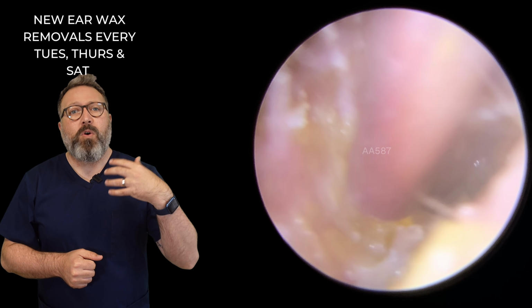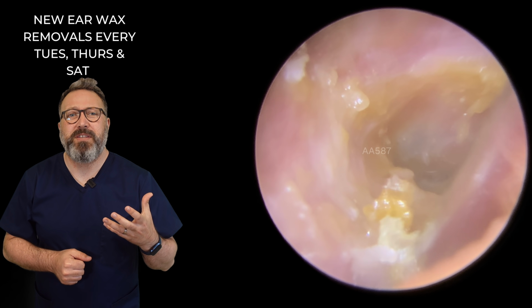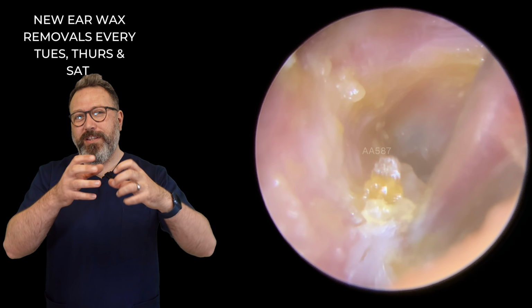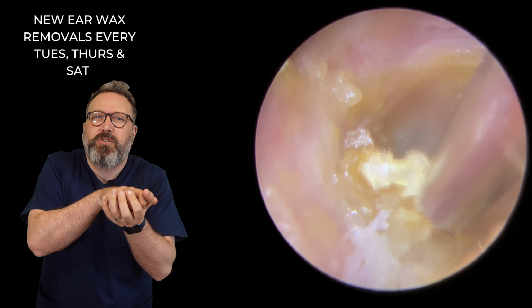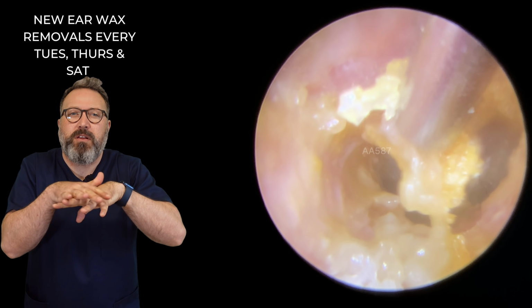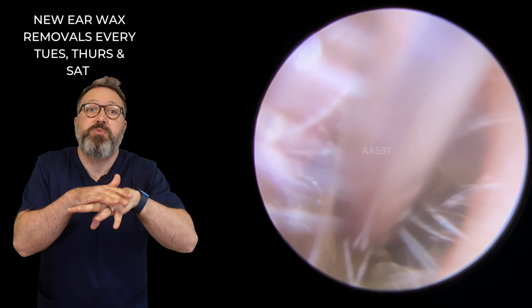Now, what does the patient feel when this is happening? The patient's going to feel lots of pulling sensations. They actually really enjoyed having the suction done. And the reason being is when you've got these layers of dead skin, or some really hard wax on the canal, it can feel really itchy. And the reason for that is because these two layers are passing over one another with things like jaw movement and stuff like that, it's basically causing a little bit of friction, which is where the itch is coming from.